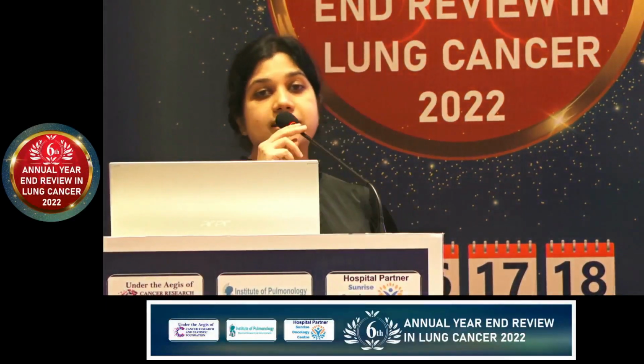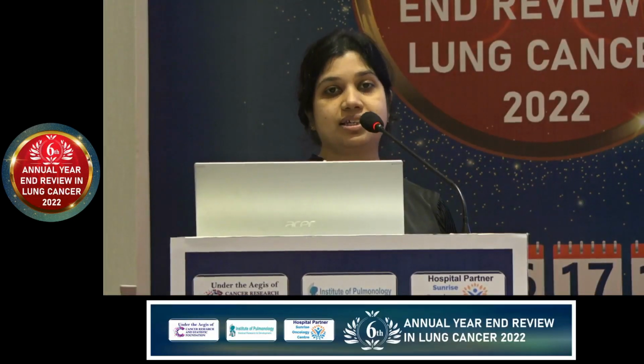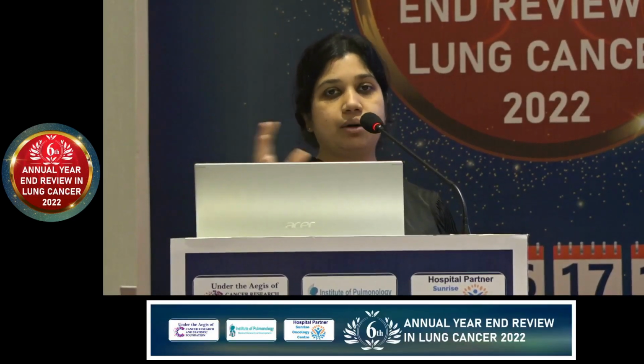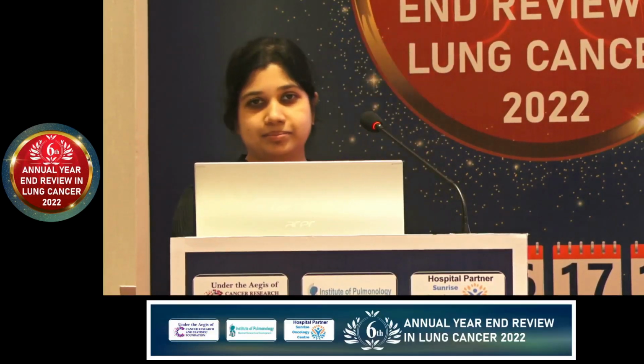No, so there's a difference. Multiple solid or ground glass. If it's ground glass and we are suspecting they are in situ carcinoma, then we can give that kind of a descriptor. And if there are multiple lung nodules, then definitely it's metastatic. So the difference is in the attenuation. Thank you.